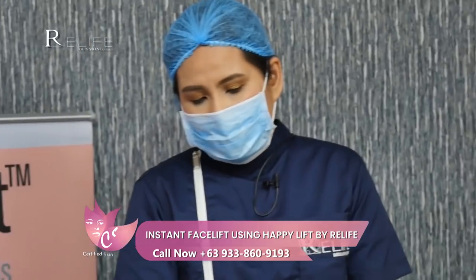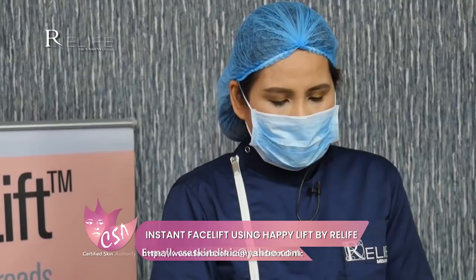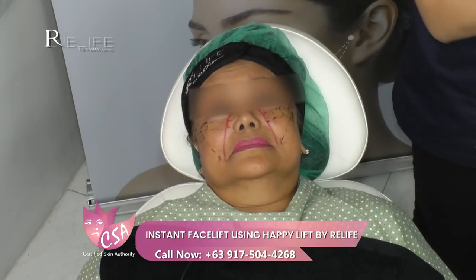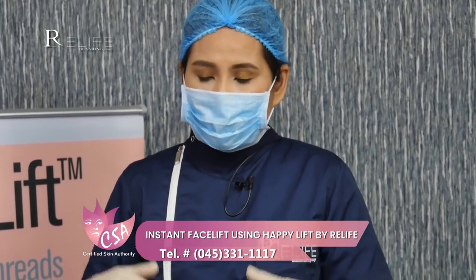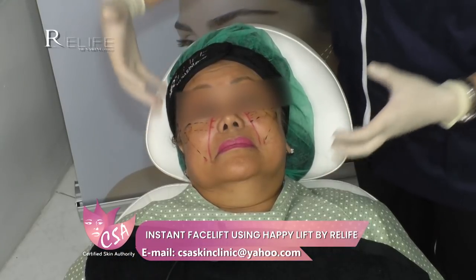These revitalizing threads are indicated for senior citizens — Ma'am is in her 70s — those who want a lifting without surgery. This is a procedure you can do for them. For others with really severe sagginess, surgery may be advised, but for some people who don't want surgery yet, we can still do this, although ideally we want to do this for those with moderate sagginess.